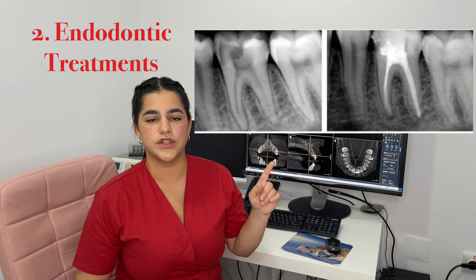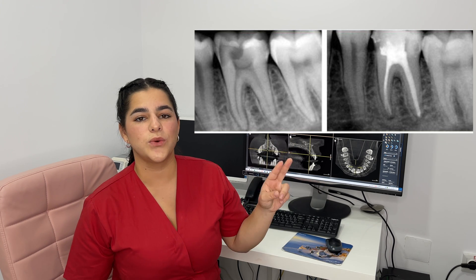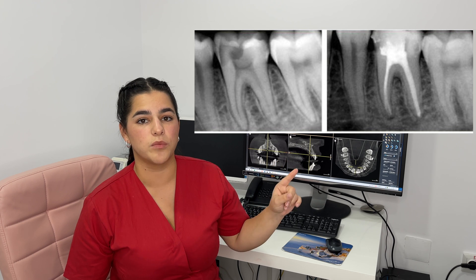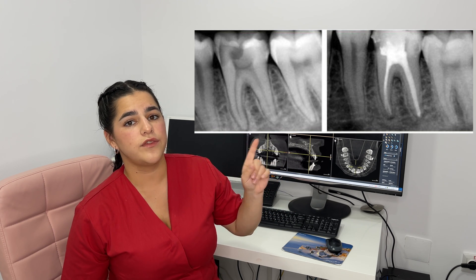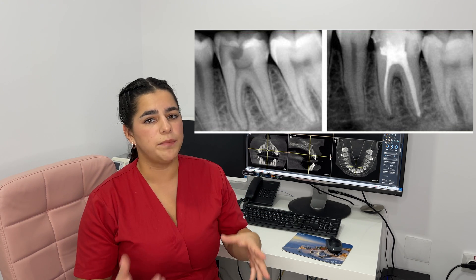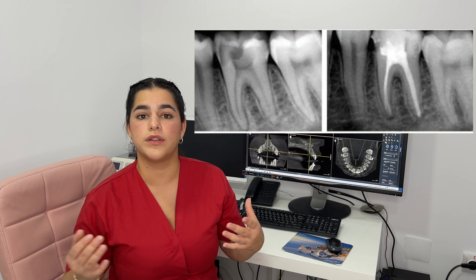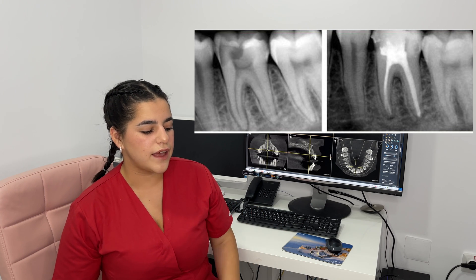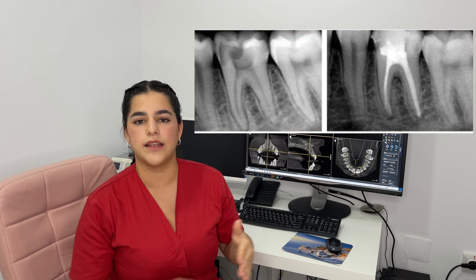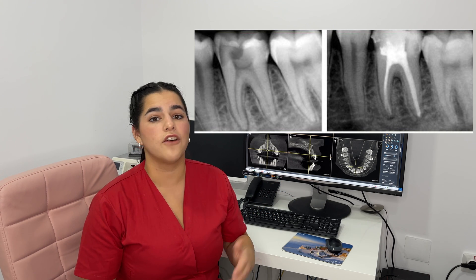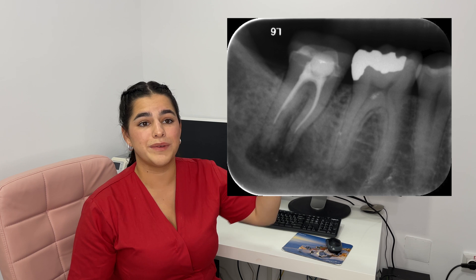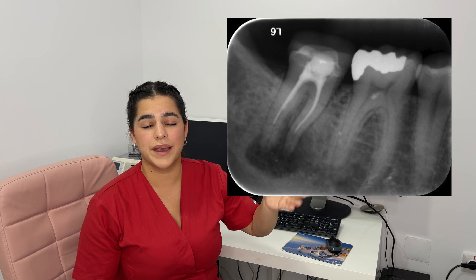This next image shows endodontic treatments. We're looking at tooth 3.6, the first lower molar. We can see a very big cavity that penetrated and, when opened, reached the pulp chamber — meaning an endodontic treatment was required. In the image next to it, you can see the endodontic treatment completed properly, reaching the apex. But we can also have bad endo treatments — for example, one where the fill did not reach the apex.